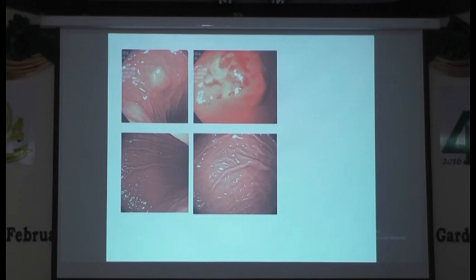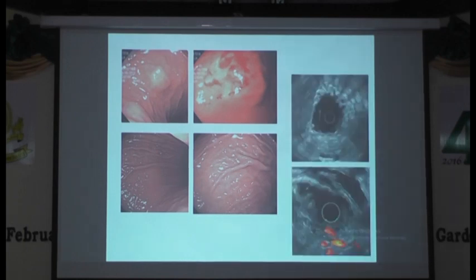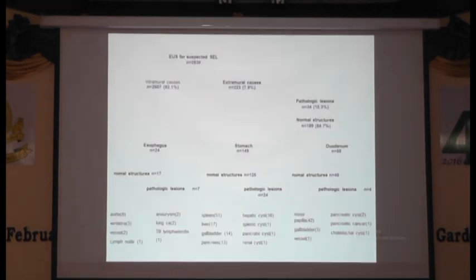And then I switched on the endoscopic ultrasound, and I could not find any mass lesion, any intramural mass lesion. But at the place where the doctor had seen something, I could find many vascular structures compressing the gastric wall. So splenic vessels compressing the gastric wall can be misdiagnosed as a subepithelial lesion.